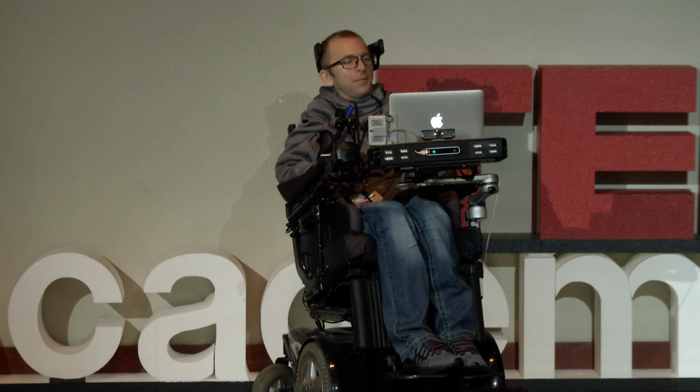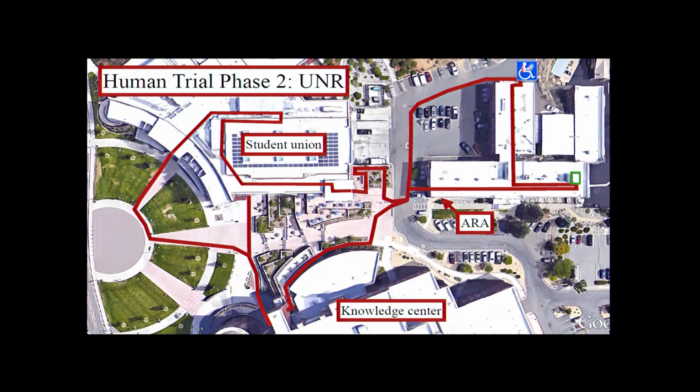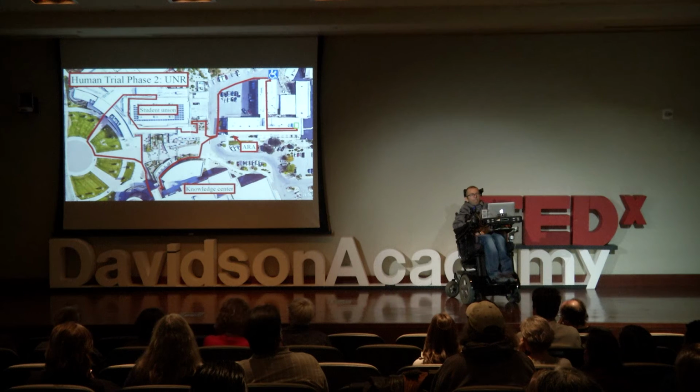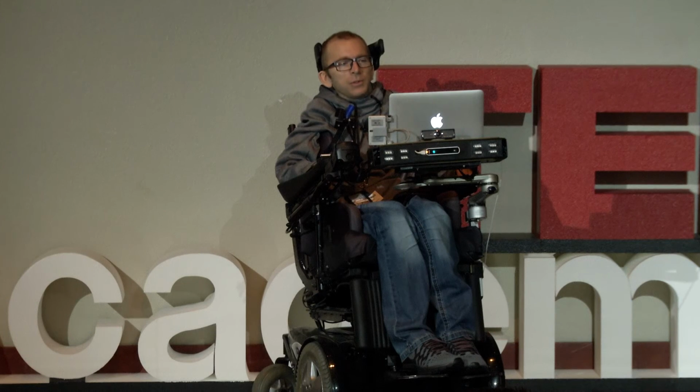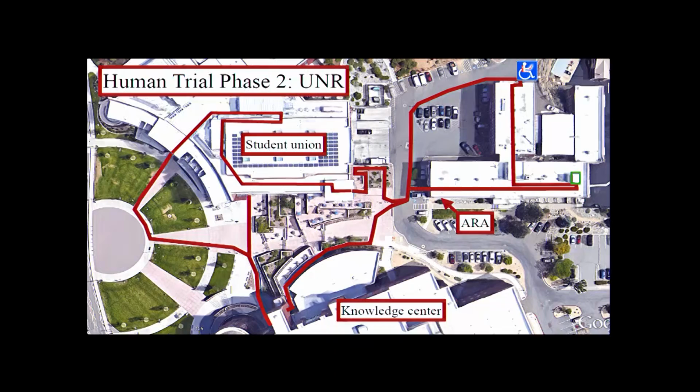Okay, next slide. So phase 2 will be on the UNR campus, and it's going to be a combination of able-bodied students in our department and some local power wheelchair users. And like I said, everybody's going to have to pass the wheelchair skills test before they can go out. And the course will take us from the ARA, my lab, out to the student union, and then down over here to the Knowledge Center where we are today, and then back up to my lab.